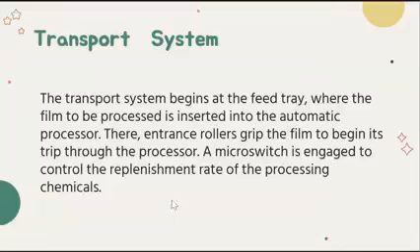Okay? And of course, the entrance rollers, once the film is positioned in the feed tray, entrance rollers will grip the film. No? Siya ang magkuha sa film to begin its trip through the processor, and a micro switch is engaged. Once the film is sensed by your micro switch, replenishment rates will start, no, with the chemicals.